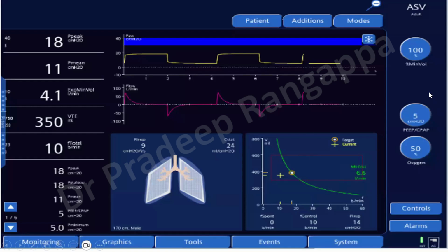So if you look very carefully, I said you set 100%. So here you see 100% minute ventilation is set. I said in ARDS you set at 120%, so you have to just tweak it to 120%. If it is asthma or COPD, tweak at 90%. Normal 100%. Others 110%. And you have to add 20% if they have fever of more than 101.3. You might have to add 5% if they are above 1,618 feet above sea level. So you have to set at 100%.